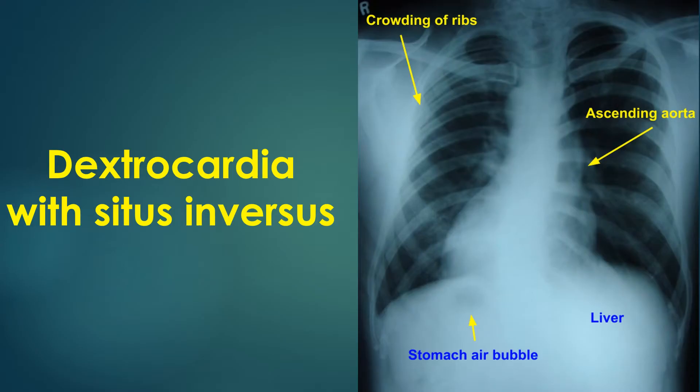Dextrocardia is evident as the apex is pointing to the right and the right atrial contour is seen on the left side. The gastric air bubble is on the right, below the diaphragm, and liver shadow on the left, indicating situs inversus. The ascending aortic shadow on the left is a little prominent.